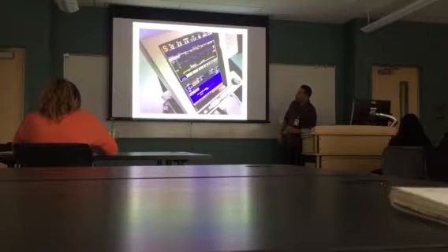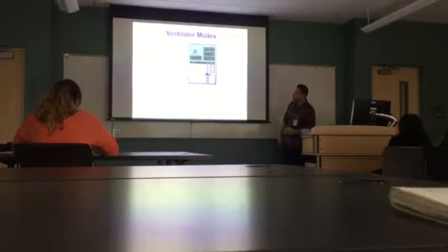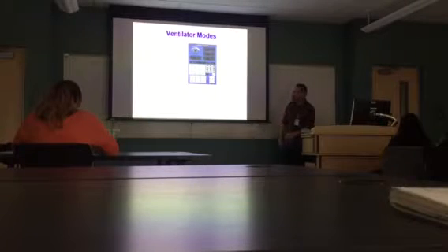And you would see that on all these ventilators, they let you know, is it assist, or is it controlled, or in this case, spontaneous.